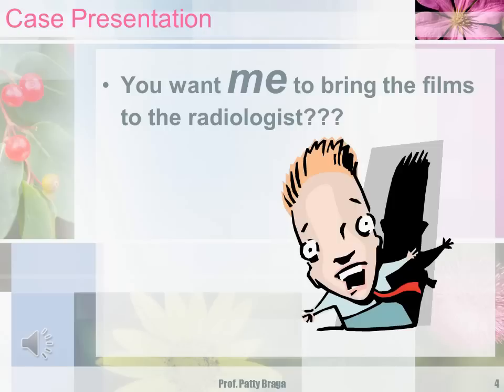So the things that you have to remember is obviously why are you doing this exam, the patient history, any previous workup or surgeries and labs, and if you know he's had other modalities, CAT scans, MRIs, you want to let him know so he can pull it up on PACS so he can compare the studies. And then you need to be able to explain why you did what you did and what you saw. That doesn't mean you need to know what it is or make the diagnosis, but you just need to be able to explain those in a logical manner.